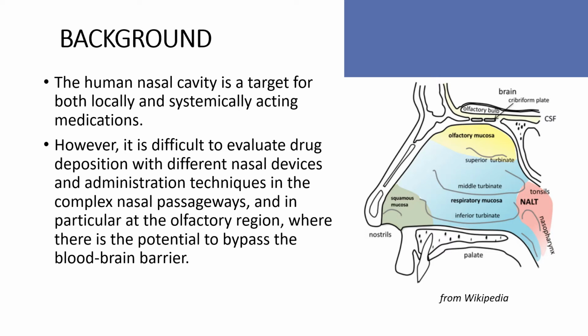Nasal models with anatomically accurate internal structures have been developed in recent years to provide realistic information regarding likely deposition of active pharmaceutical ingredients in the process of developing improved delivery systems.